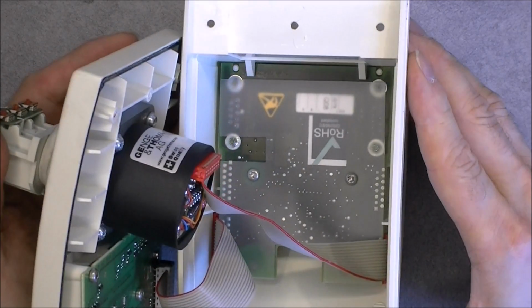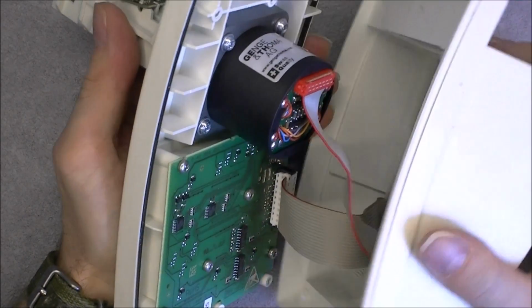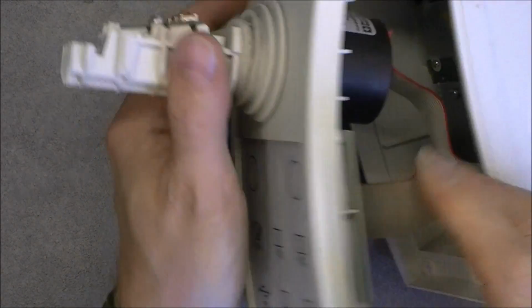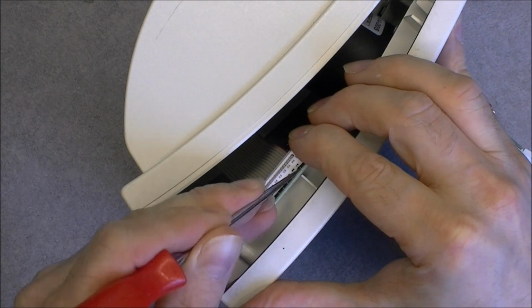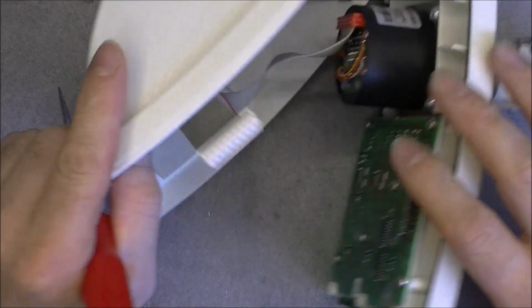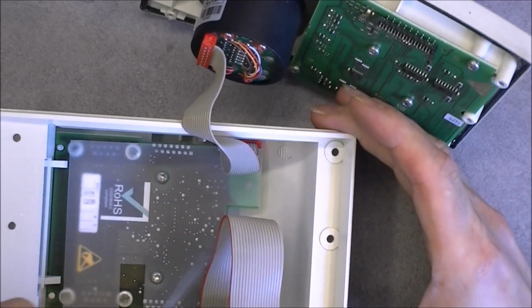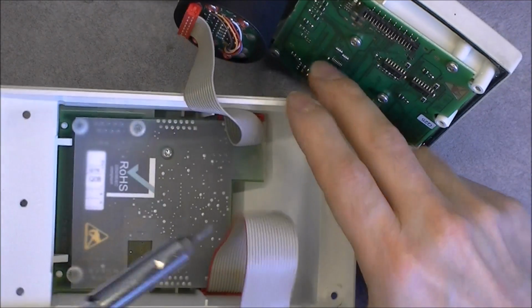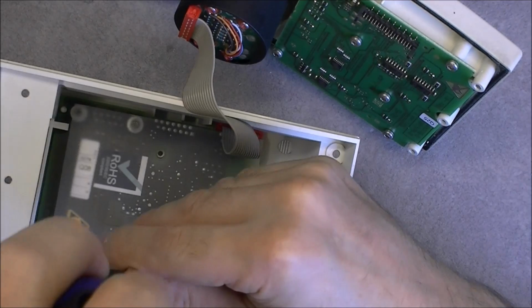So it is a little bit weird because in fact you can see we have bottom PCB with the connectors, top PCB for the keyboard in fact, and the very nice controller assembly. So here on this flat flex I have a connector. So I should be able to disconnect it, but actually they are pretty hard to undo. Okay, but on this other part here, this is soldered in place, and the connector at the other side cannot be reached until you remove this PCB. So it is a little bit of extra work if you just want to replace the joystick piece, I guess.